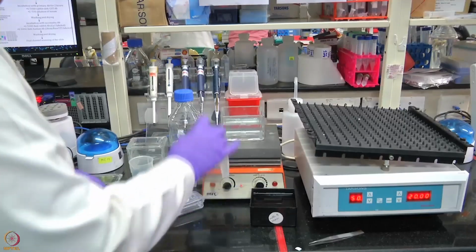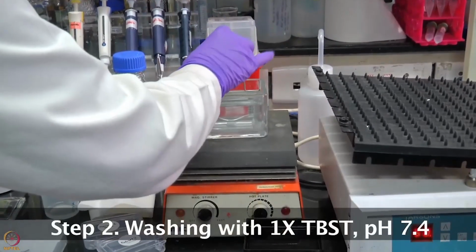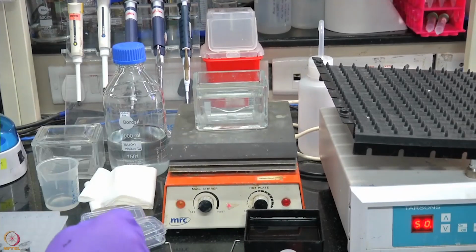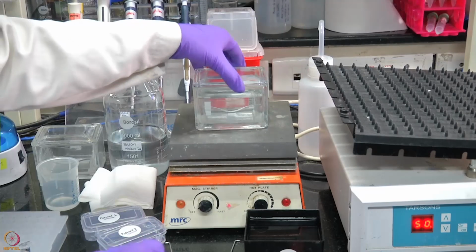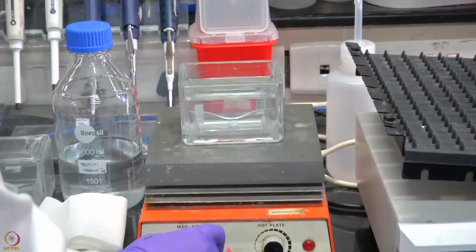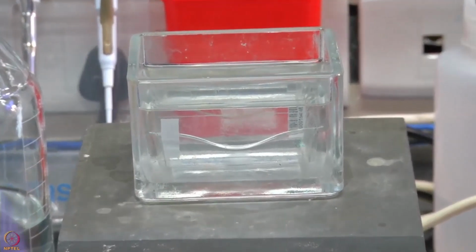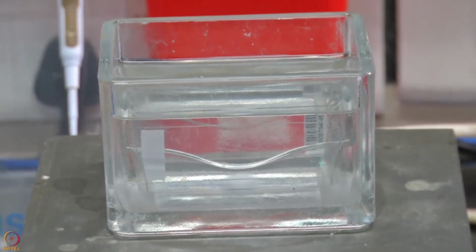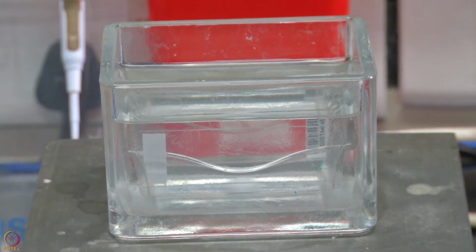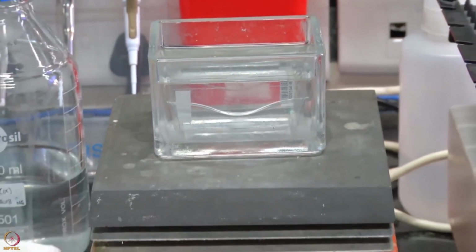Now we take the cassette and place it into the buffer for washing. This buffer is 1x TBST and the pH is set at 7.4 so that the protein structure remains intact. Now we just start. Here you see there is a magnetic bead which is used for the circulation of the buffer. We start the magnetic bead, and the circulation of the buffer makes sure that the slides are washed properly so that the extra blocking buffer present over the protein spots can get removed properly. This washing step is performed thrice for 10 minutes each.